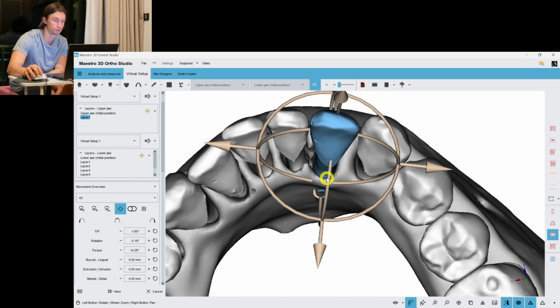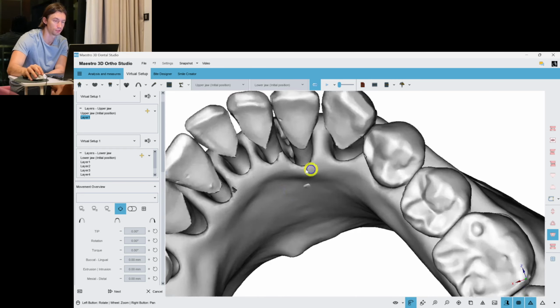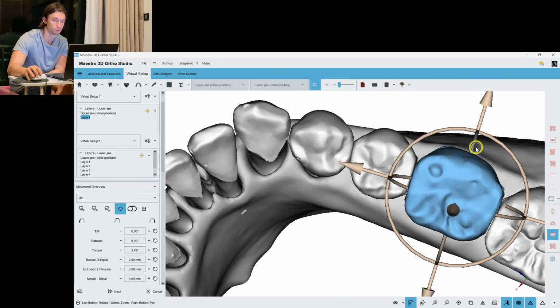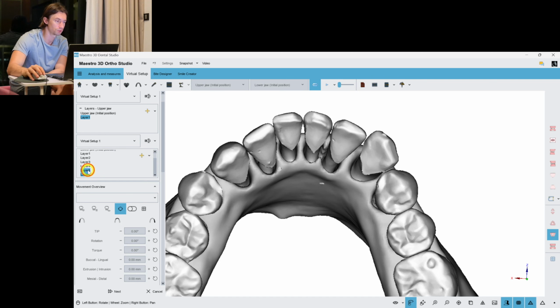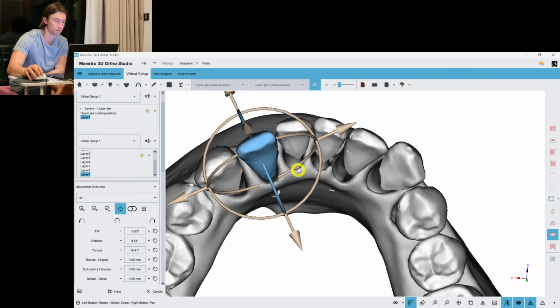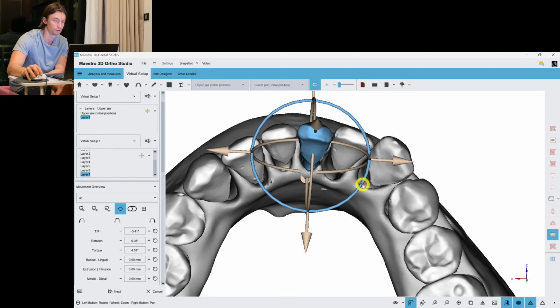Move the incisors up. Now, this is our limitation. We see the root through the bone, so it's time to stop to procline. From this point, it was layer 6, layer 7. Align the frontal teeth. We can start to move the incisors backwards.